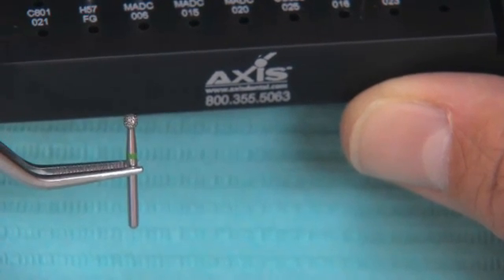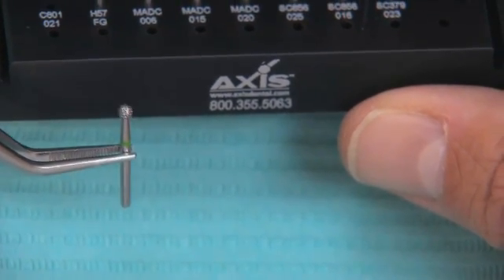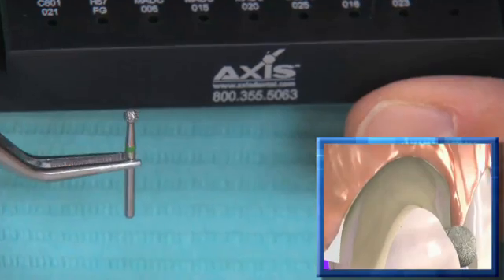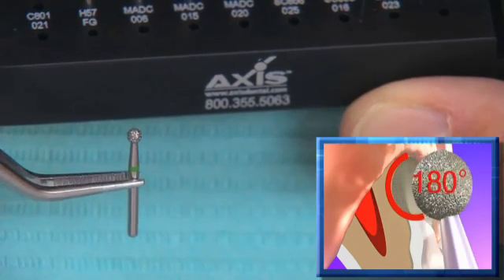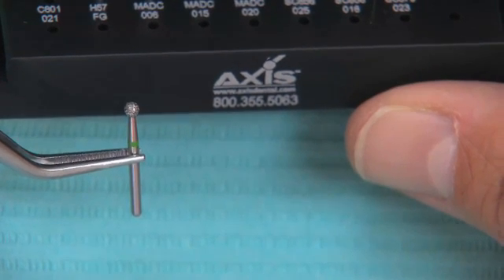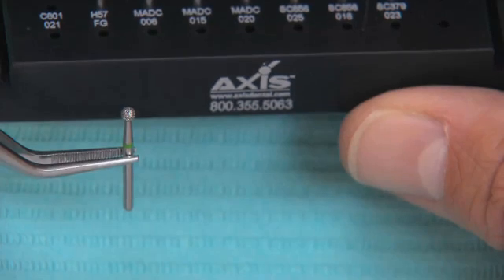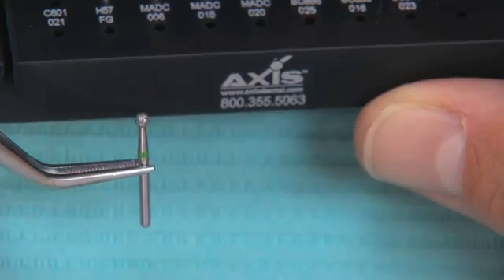The 801021 burr is probably the one you haven't used much before. It's a round diamond, used right after breaking the contacts and placing the first retraction cord to actually prep the margin. When it's sunk to half of its depth, it cuts a perfect half circle in the gingival third of the tooth — assuring enough reduction there and cutting the margin as a perfect half circle. When we do axial reduction, we're left with a quarter circle, which is the shape of a perfect chamfer or shallow shoulder.